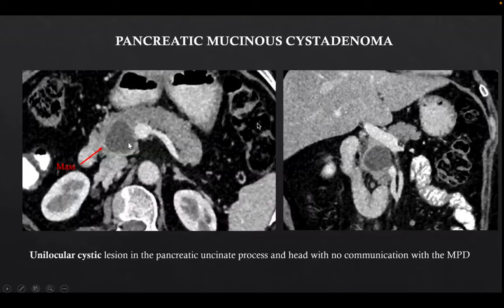This was a case of pancreatic mucinous cystoadenoma. We can see a unilocular cystic lesion in the pancreatic uncinate process which is not communicating with the main pancreatic duct.